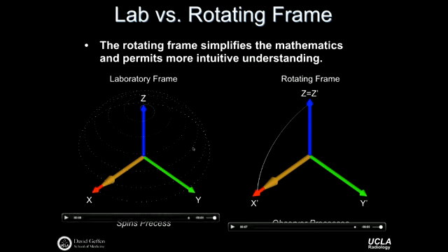And so when we demodulate, or mathematically get rid of this precessional behavior, the only thing we observe is the bulk magnetization tipping down into the transverse plane. The state is still the same. It still ends up with magnetization fully in the transverse plane. It's just mathematically and conceptually easier to visualize what's happening in the rotating frame as opposed to the lab frame.